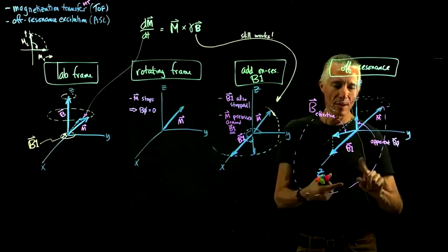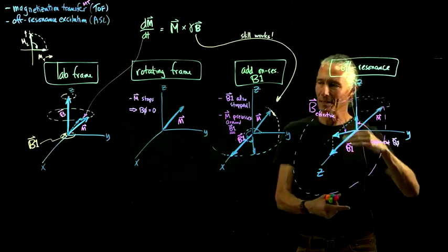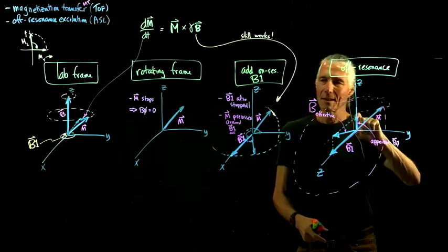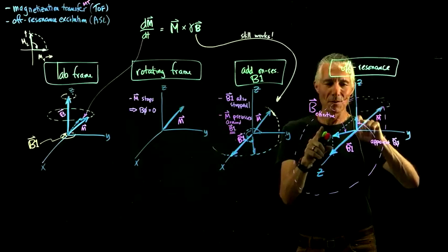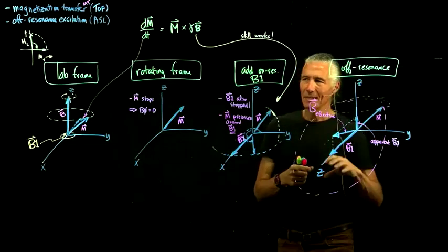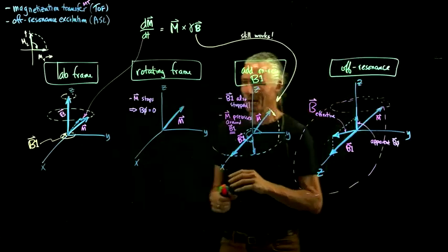So you can imagine if we start off above or below the frequency and then sweep through the center frequency, we can create a positive fake B0, then going down to 0 and then making a negative B0. And so you can think of it as a way to invert spins. So we'll come back to that and go over it a third time.